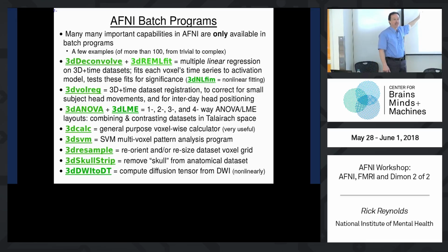Scanners were doing real-time registration using this software in like 1988. So it's built to be very fast. But of course, you don't care now because everything's fast enough. But anyway, that's what it is.